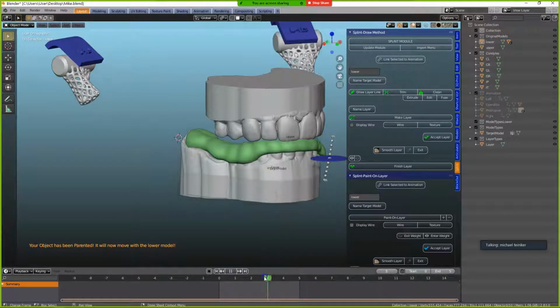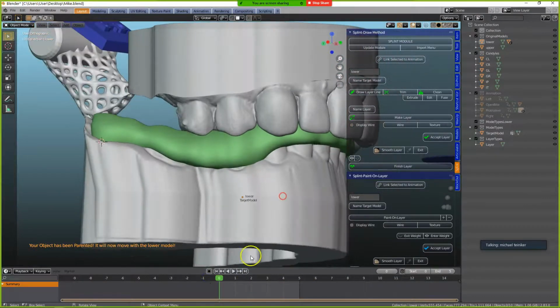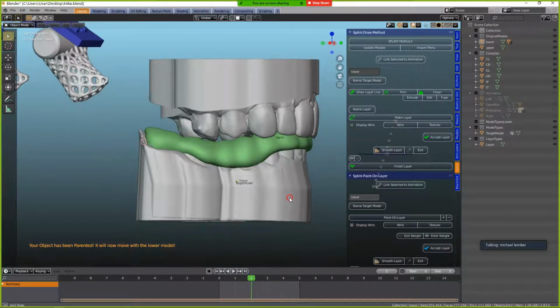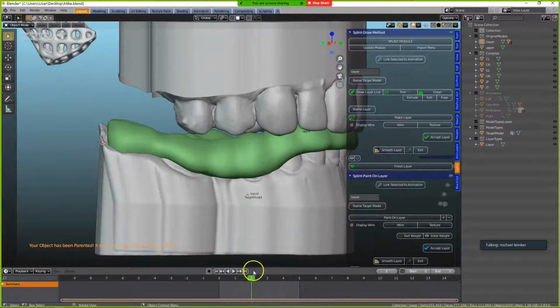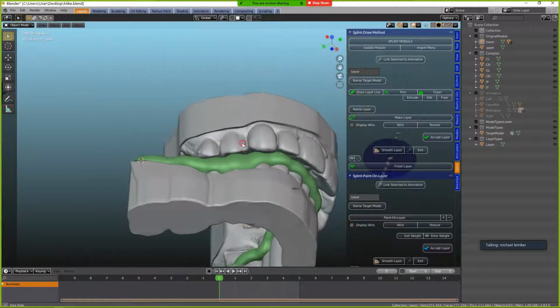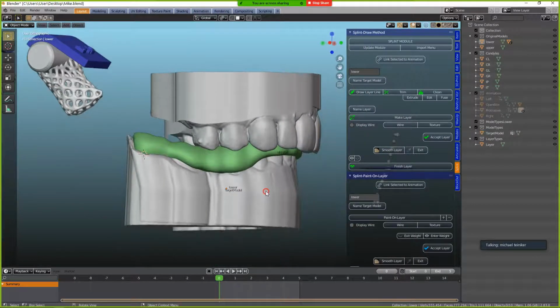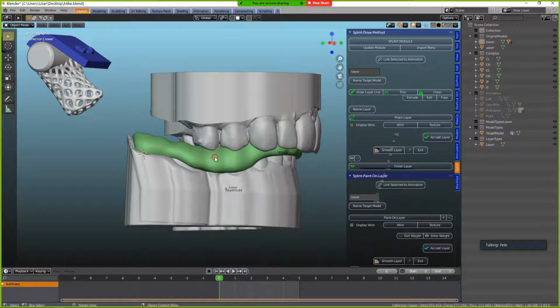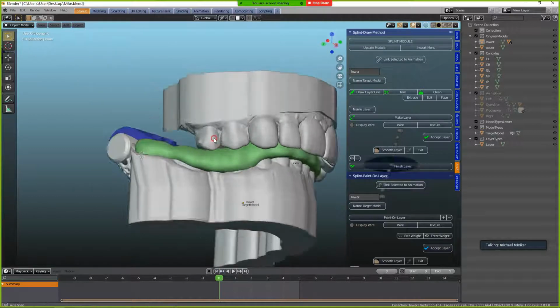Now, if we have it disengaged, we may be missing a little bit of material. I don't know whether you just want a layer, or do you want us to put a bit of material like a rim, a bite block rim. Yeah. All right. So we don't have to go all the way back.